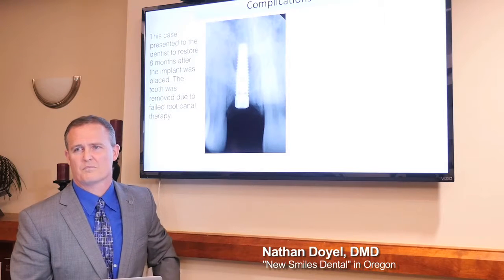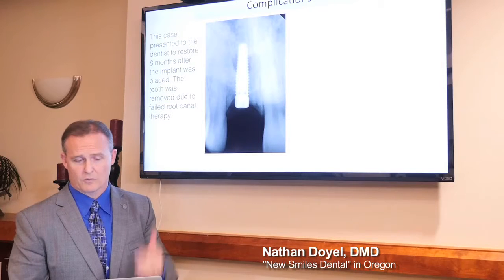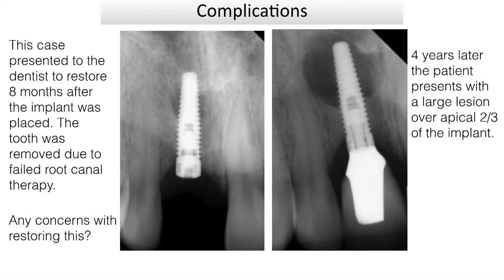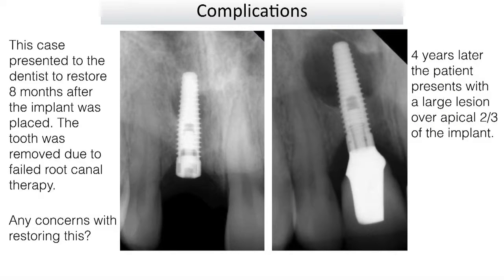Most likely leftover granulation tissue. That's exactly what it is. Leftover granulation tissue that's been left over when they took out the tooth. We knew that this is what it looked like 4 years later when the patient came back to the doctor who restored it, and had this draining fistula. They didn't know this was a failed root canal tooth, that when they took the tooth out, they didn't get all the granulation tissue out of there, and over time it was a source of infection to grow. So, what went wrong, and when did it go wrong?